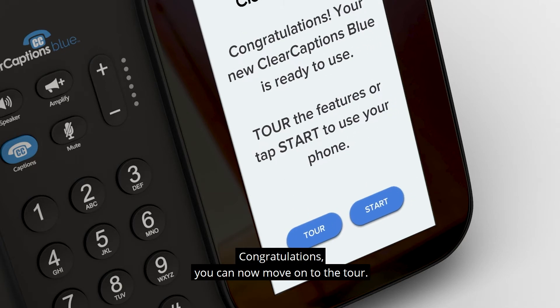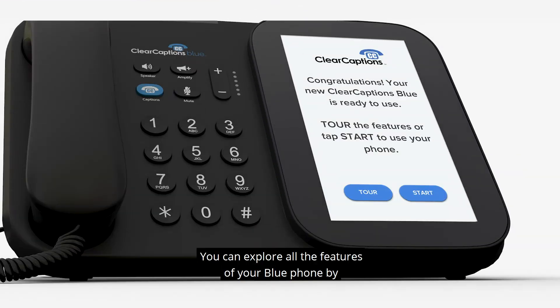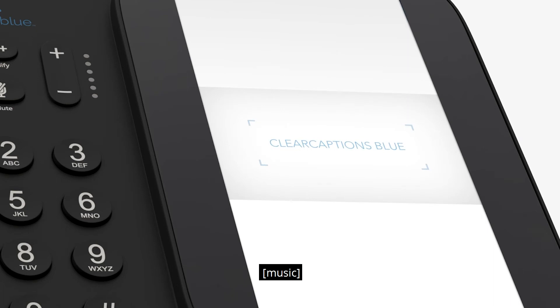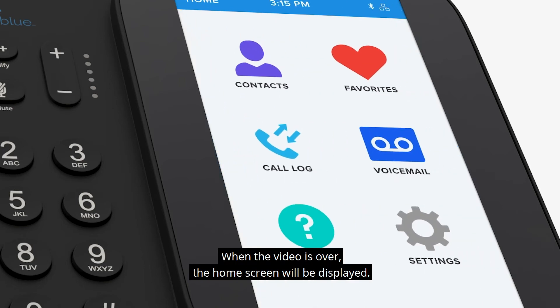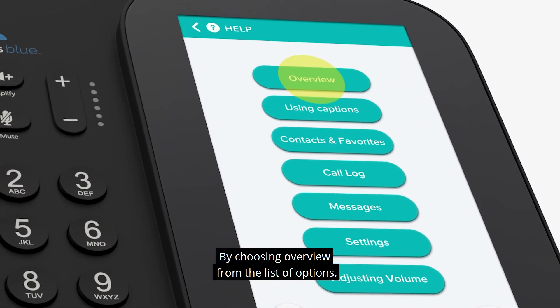Congratulations! You can now move on to the tour. You can explore all the features of your Blue Phone by tapping the Tour button and watching the overview video. When the video is over, the home screen will be displayed. You can watch the video again at any time from the Help section by choosing Overview from the list of options.